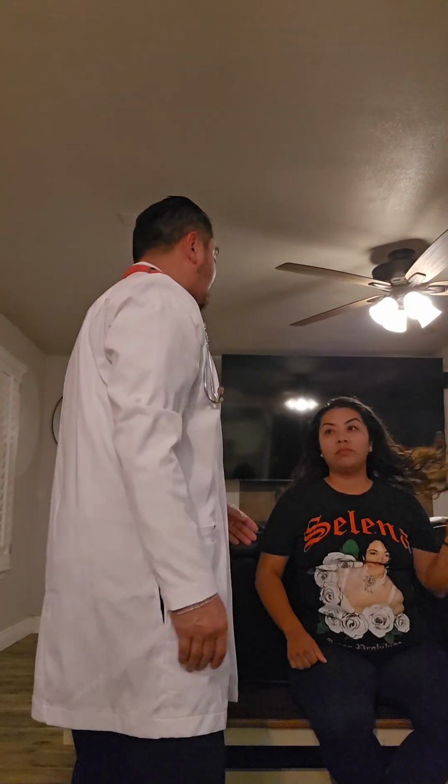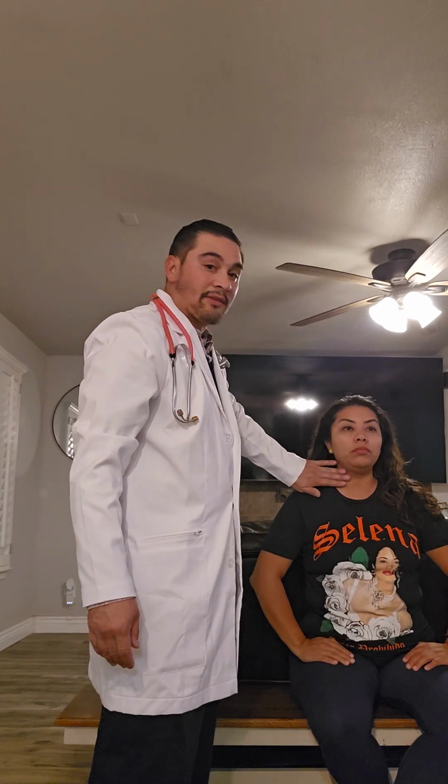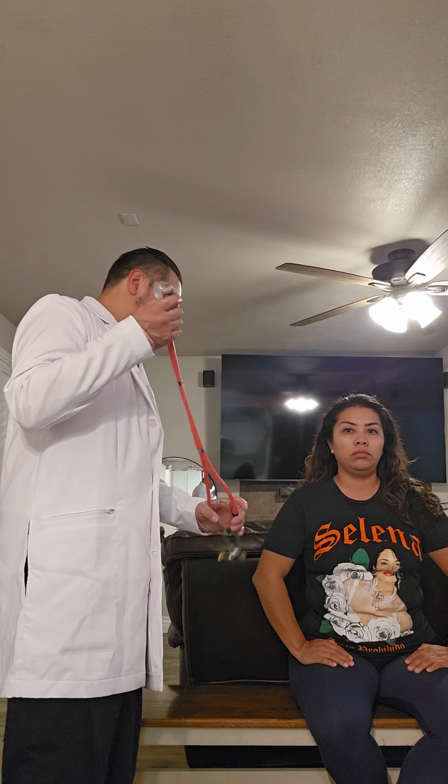So I did take the time at the beginning, prior to having her lie down, to identify where we had the carotid. I'm going to go ahead and now listen to the carotid pulses. I will be using the diaphragm of my stethoscope to listen to these sounds.